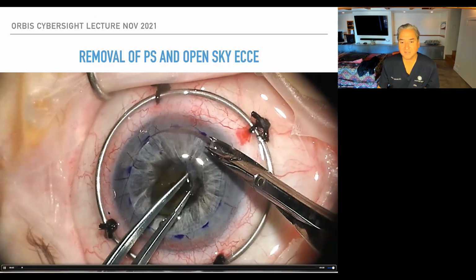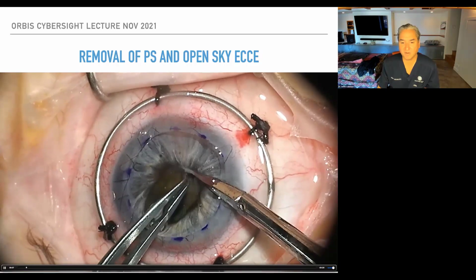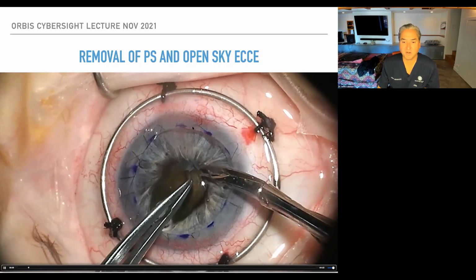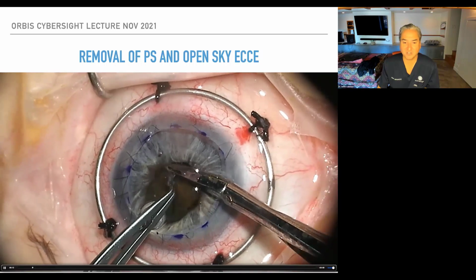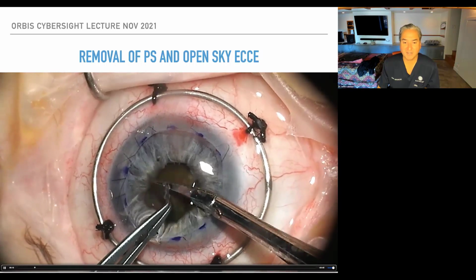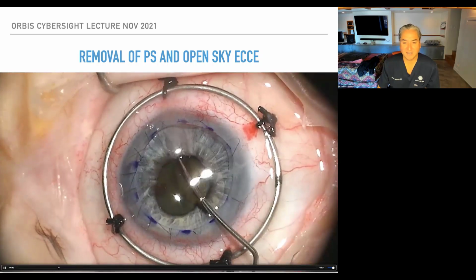This is a patient that has posterior synechia. You can see all that scarring where the scissors are cutting right here, almost a pupillary membrane. And then they've had a previous transplant. You can see some stitches here. And so I'm removing that pupillary membrane, and then we're going to be left with that dense cataract.